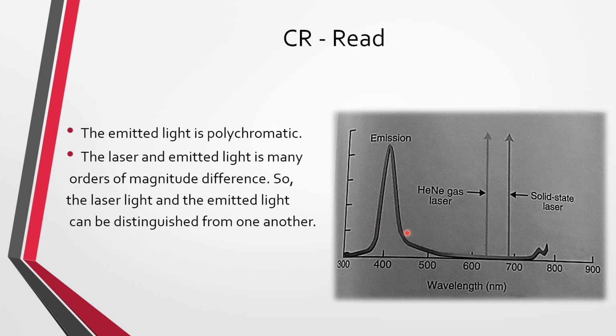So the optics and the electronics are focused on only looking at this light, and so the laser won't add noise or disturb the acquisition process of the information, which is just the light being emitted off of the image plate.